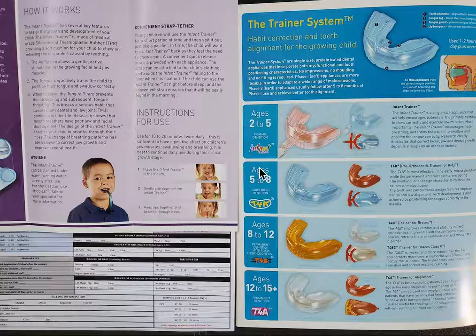bones, meat on the bones, chewy vegetables, stuff like that. It's just not happening unless you're in a tribe. So for that reason, crowding happens, right? And bite issues happen because our jaws are underdeveloped. So the infant trainer is supposed to encourage nasal breathing and help to improve the correct swallow, the correct tongue position, etc.